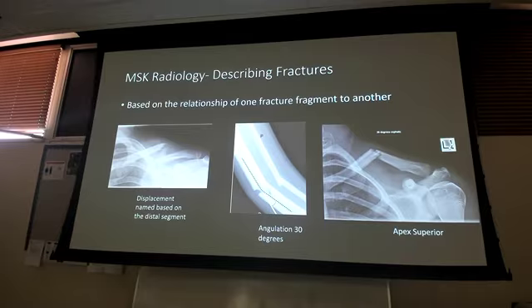Again, mostly simple fractures, right? Because if it's comminuted, I may have an apex there, but really the comminution is the more concerning thing, it's in a bunch of pieces. But yes, this can happen in the tibia, the fibula, the forearm. Which way is that pointing? You can use that for any of those bones, yep.